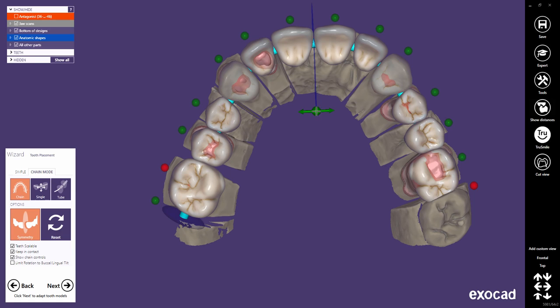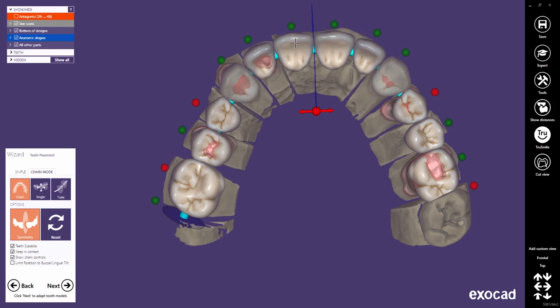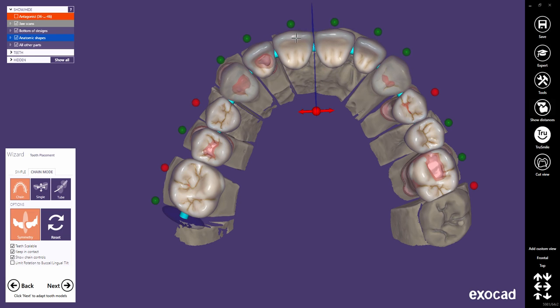If you lock the control point, the symmetry plane will stay in place. The control point's reference points are automatically pinned if you lock the front symmetry plane, and you cannot unlock them as long as the symmetry plane remains locked.